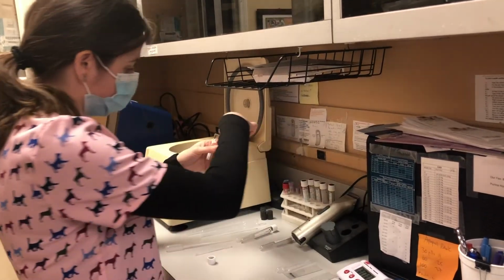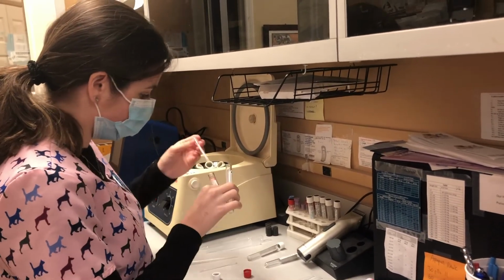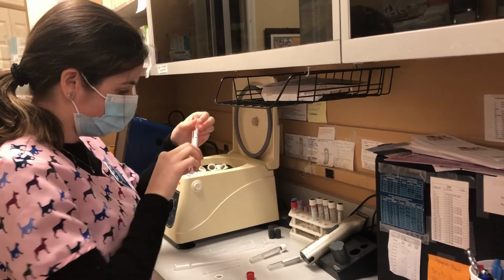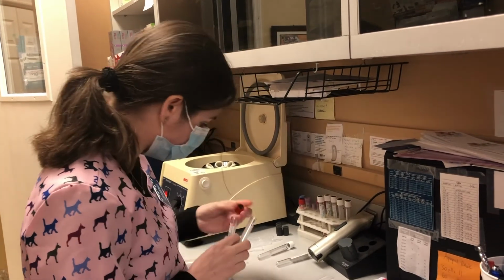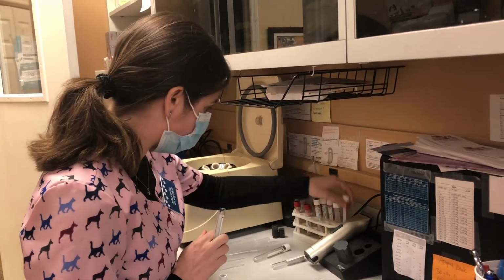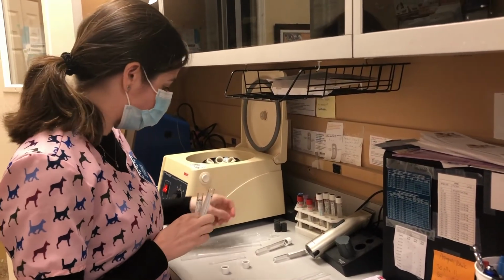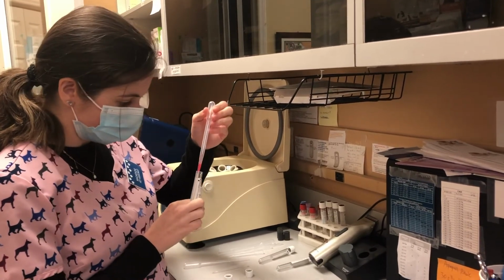I'm going to take my donor serum, drops in there, and I'm going to take my recipient cell suspension, put 2 drops of that in as well.